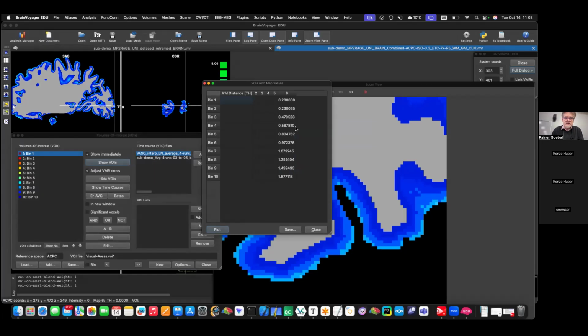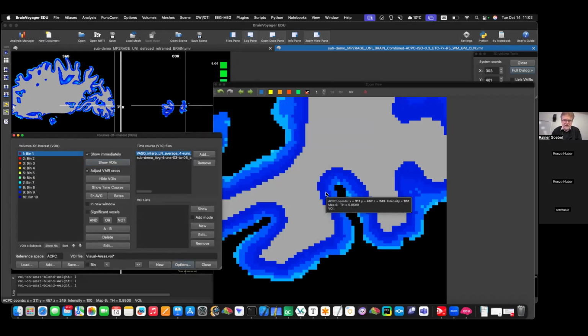And look at this, you see, of course, that it starts from a low value and goes from the white matter. So the first one I skip usually, but I could also add. So it's a little jump here, but then you see how nicely it goes up and up and up because the distance from the white matter to the gray matter, to the CSF, is in the distance map, right? And you just see this. This gives you this. But now let's look whether we get the same, or something similar, not so nice probably, when we use the statistical map.